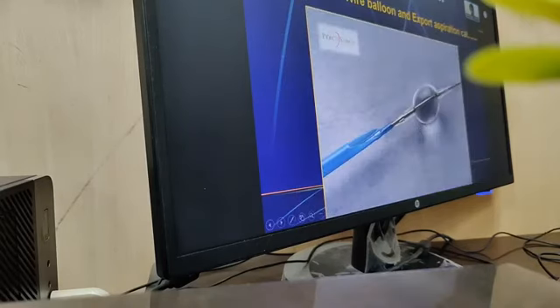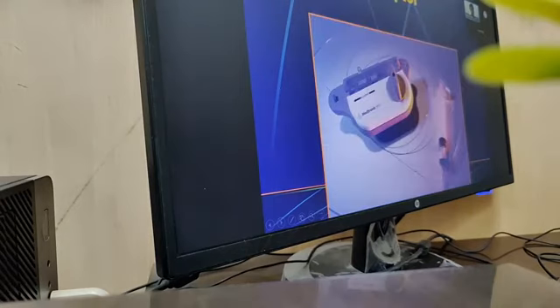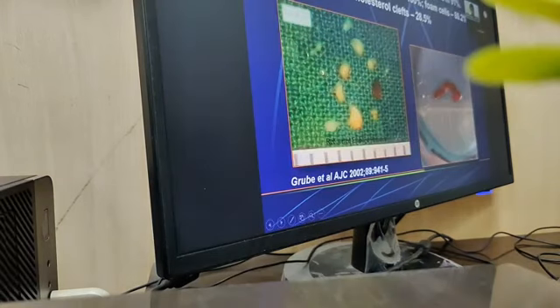You can see how the balloon is inflated distally, and then angioplasty is performed. This is the whole PercuSurge system; you can see the syringe, and it comes from Medtronic. I will show you the guide catheter, the GuardWire, which is the guide wire, and then the lesion. You have a compliant occlusion balloon, and then you perform the angioplasty, and then you take out the balloon, and the procedure is finished. This is how the emboli are trapped by the balloon, and when you remove it, they do not cause distal embolization.